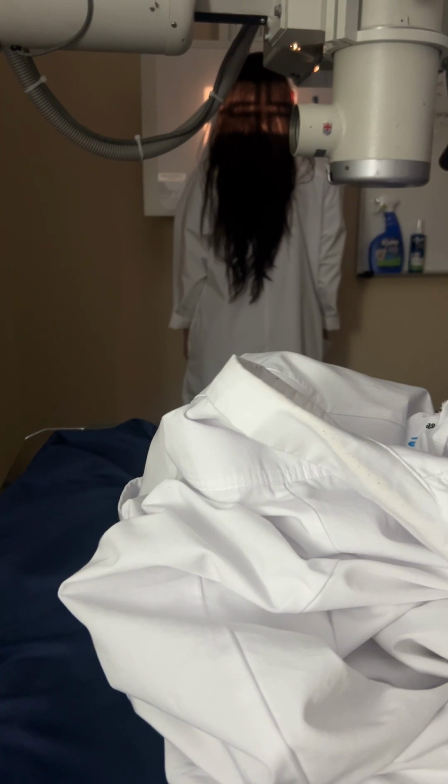The funny thing is, you guys probably won't ever do a mandible series. You'll go to an ER that has somebody with a mandible fracture and you'll just do a Panorex. It's a thing that literally just scans. It's like a mini CT.